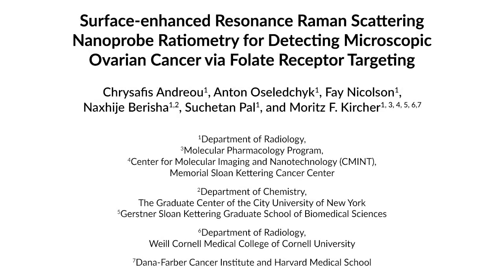This method employs topical application of nanoparticles to image microscopic tumours, especially in malignancies that do not yet have access to the vasculature, such as the metastasis of ovarian cancer. This technique is ratiometric, imaging targeted and non-targeted nanoparticles in a single scan to diminish false signals and reveal the true extent of the tumour.